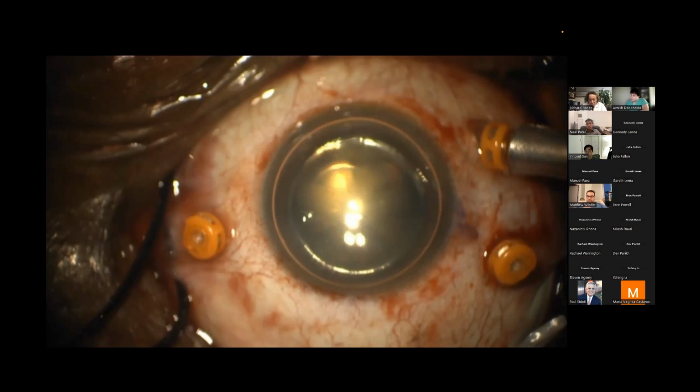We couldn't do the laser, so we did go back to fluid. And then we did phaco, like Matt said, from anterior, and then we had to restart the entire case basically. But that was just because we couldn't see anything, and that's the only reason I could think of to take the lens out.